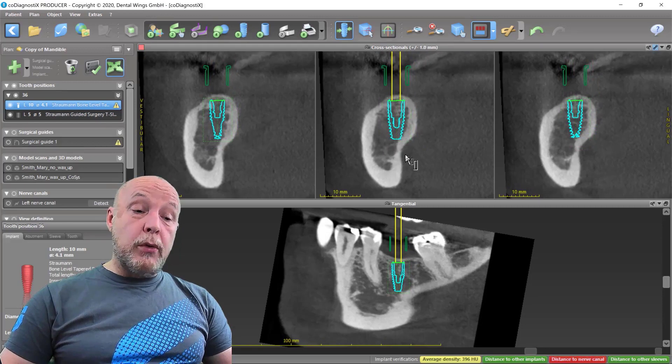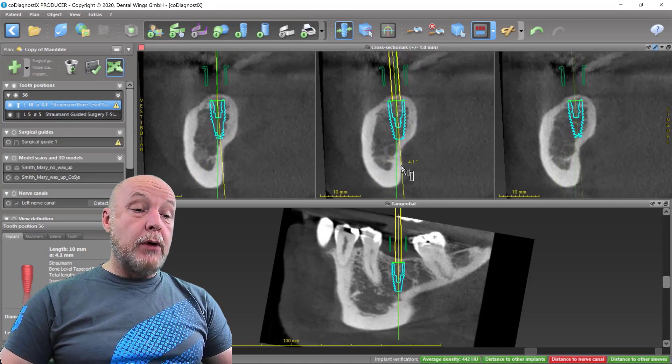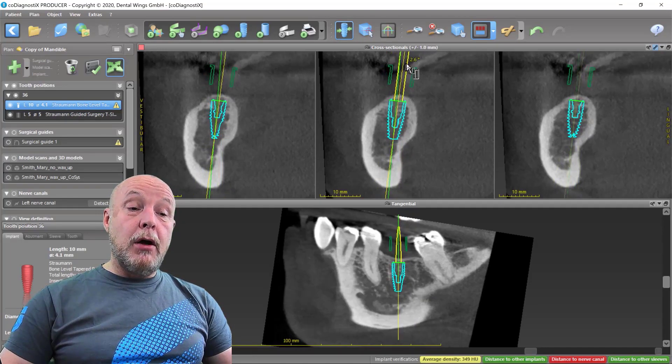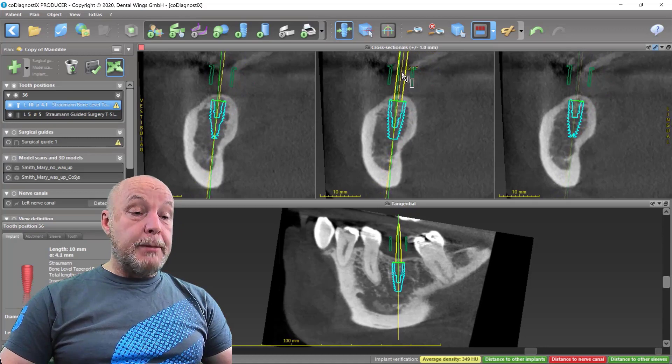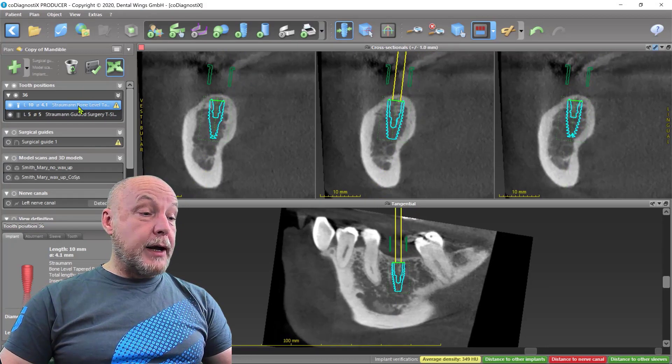If you go with the right mouse button and activate it under the implant, you turn around the shoulder. If you do the same by clicking the right button over the implant, you turn the implant around the tip.